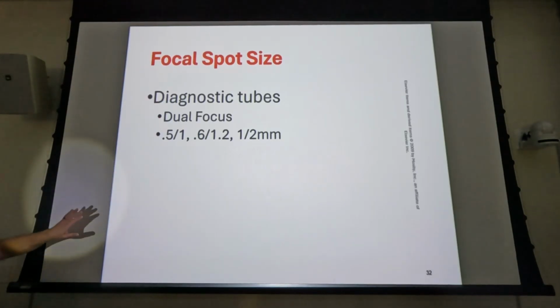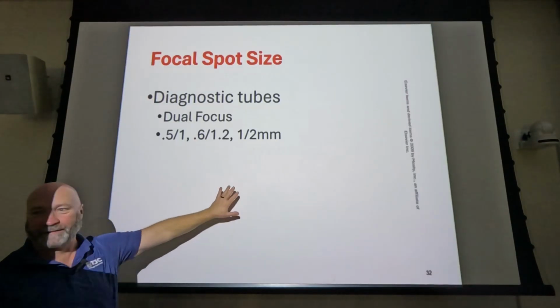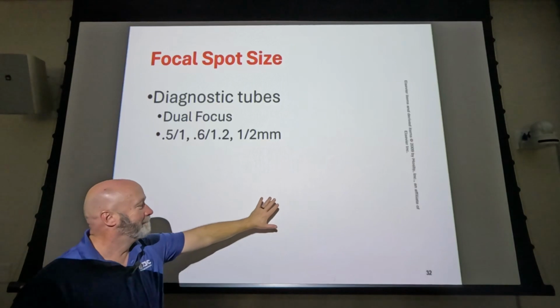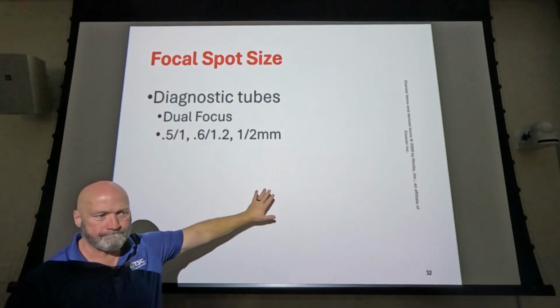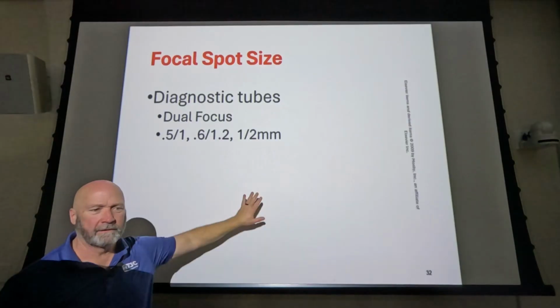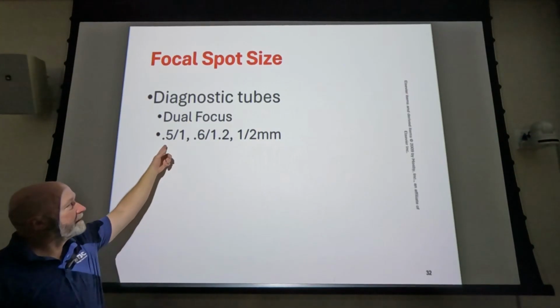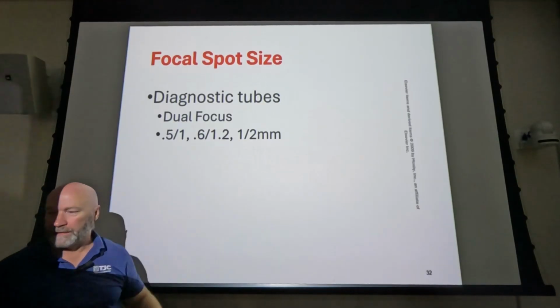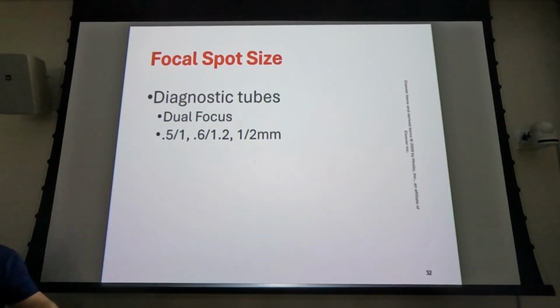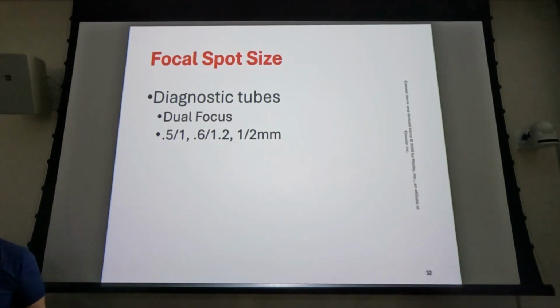Okay, so what does my shadow look like? Defined. It's a pretty good shadow. Well, I can do it over here. Yeah. So what does the shadow look like? Where is the light coming from? A little bit of area, right? So the smaller the emitter of any kind of electromagnetic radiation, the sharper the shadow is going to be, right? So large focal spot gives us a blurrier image. Is that bad?